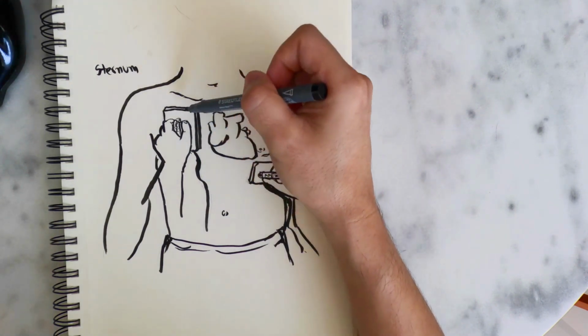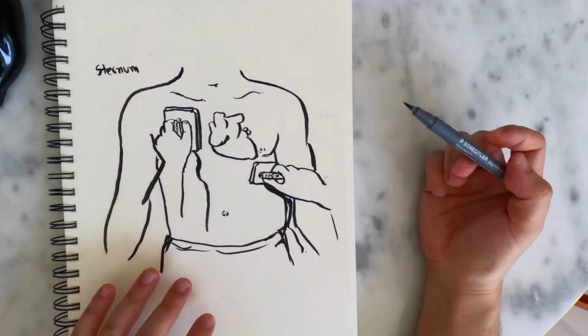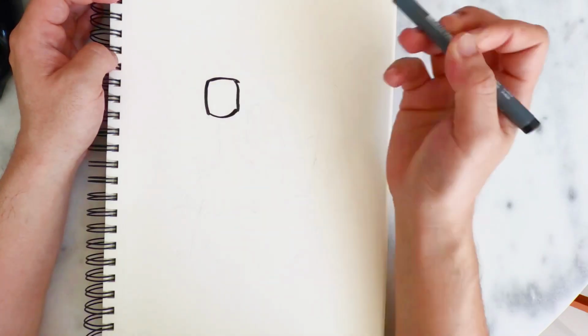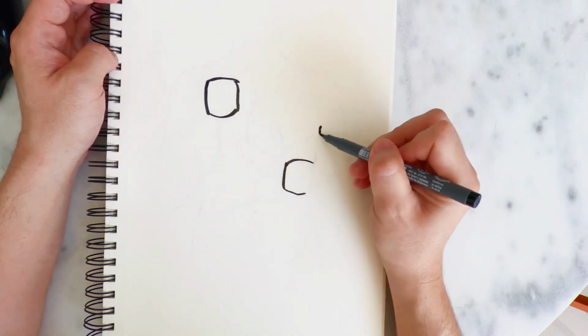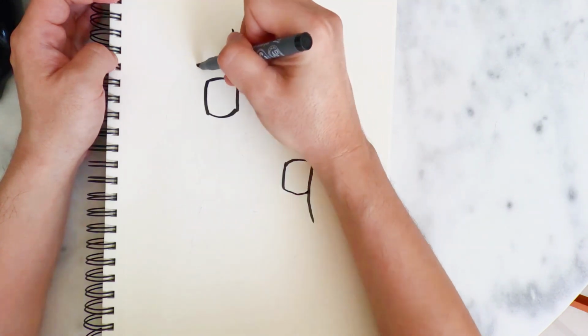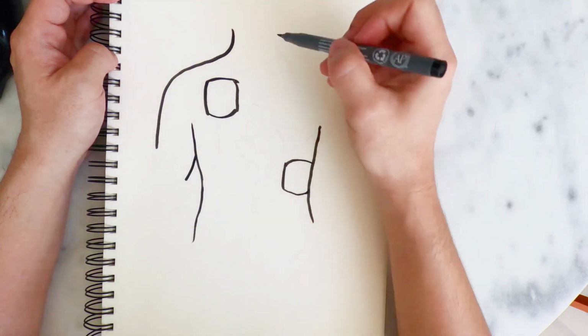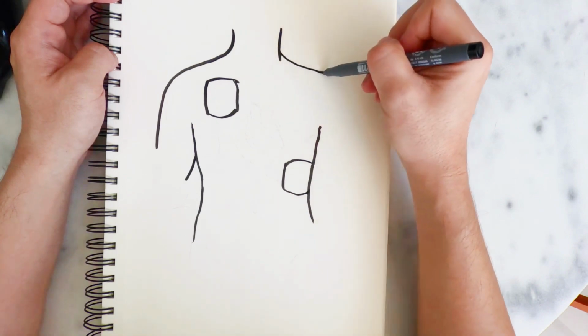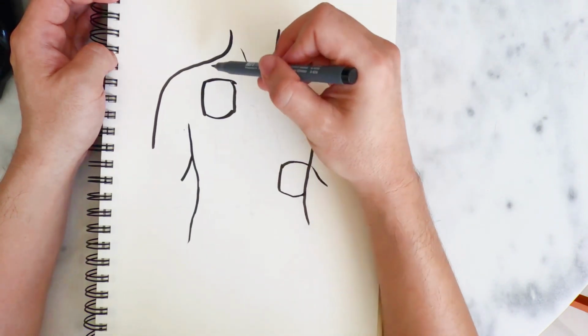The direction of the electrical current, which we will call a vector, will pass through the heart perfectly for the electrical shock. There are two modes for delivering the shock, biphasic and monophasic. Generally, we use what is called biphasic. In biphasic mode, when you press the shock button once, the electrical current will flow from one pad to the other, but it will go back and forth twice, which makes the shock more effective and requires less energy.